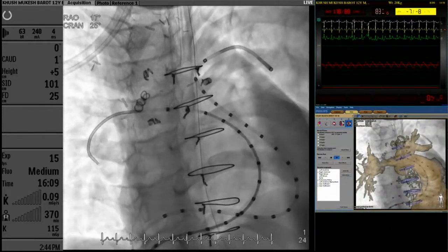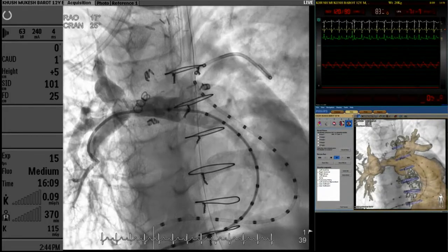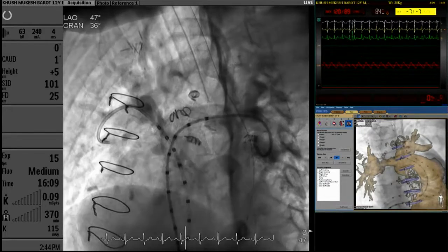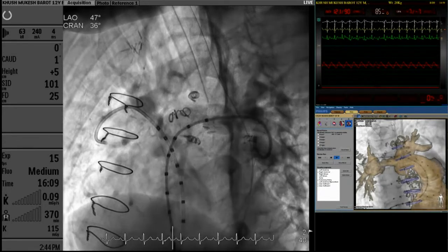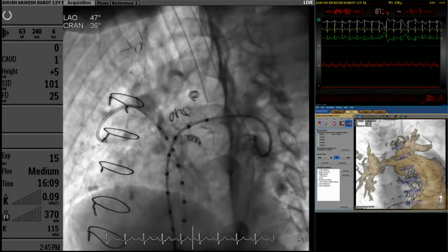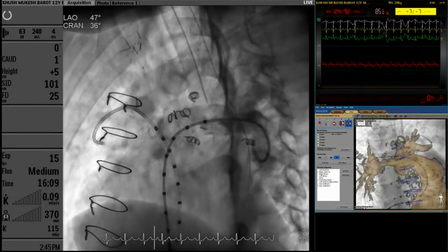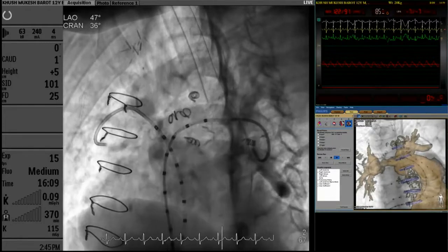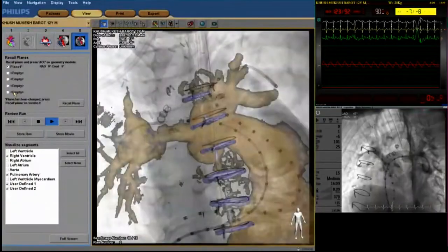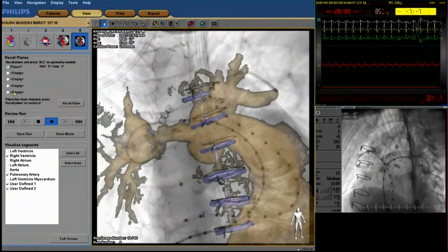The length of the lesion was 27 to 28 millimeter on the right, and around 27 to 28 on the left. But the exact stenosis is at the level of that particular pin only. So you would want to cover it, overlap it a little bit, no? If you see the CT, overlap this image with the CT. The CT scan also showed that there was a hilar level LPA stenosis as well. It was not just the ostium.